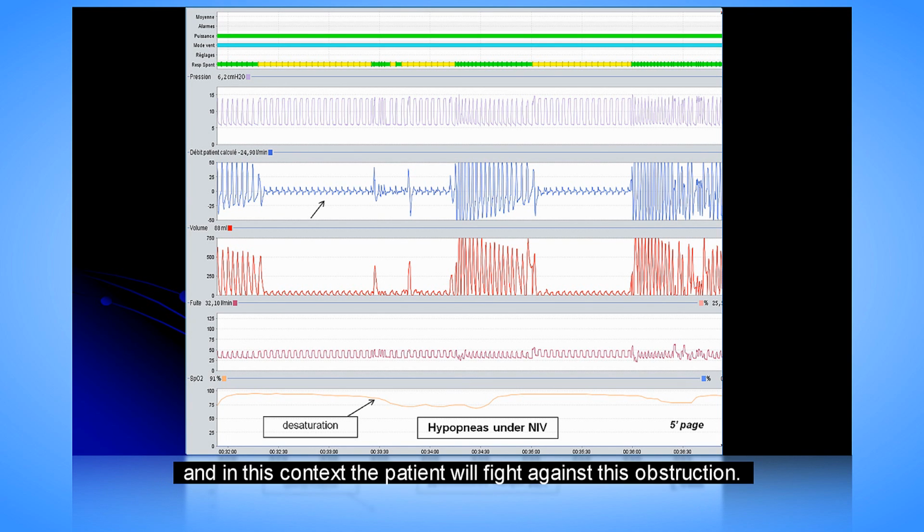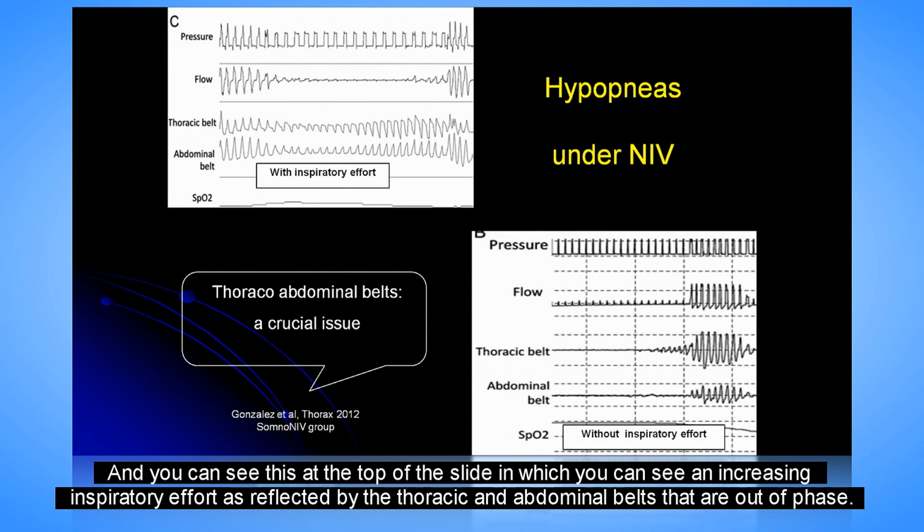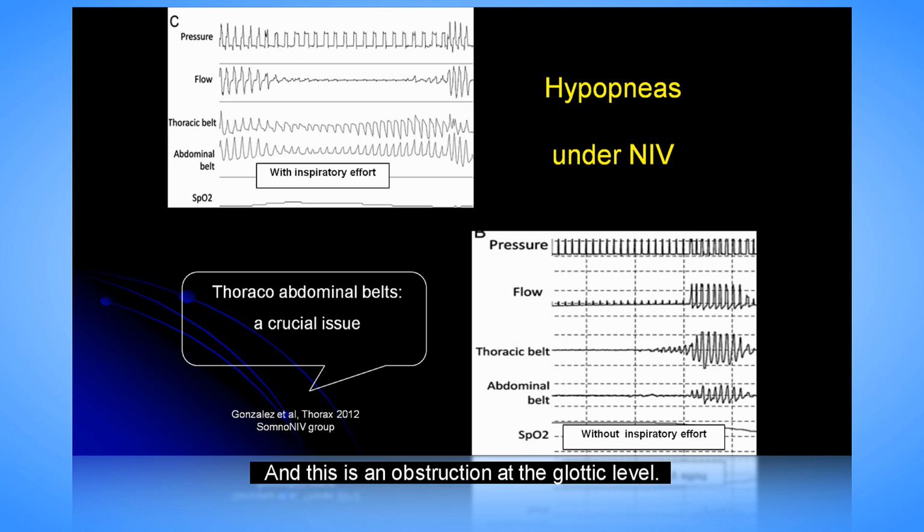tube, and in this context the patient will fight against this obstruction. And you can see at the top of this slide an increasing inspiratory effort, as reflected by the thoracic and abdominal belts that are also out of phase. But there is also a second mechanism that could explain this obstruction of the airway. And this is an obstruction at the glottal level.